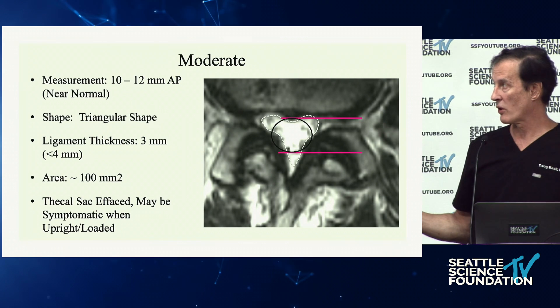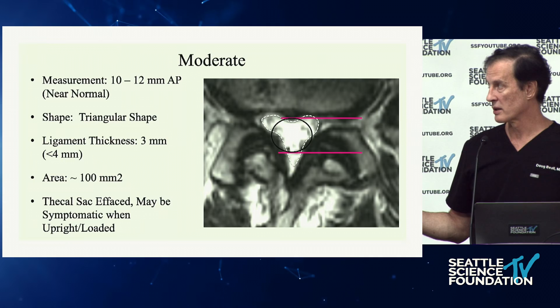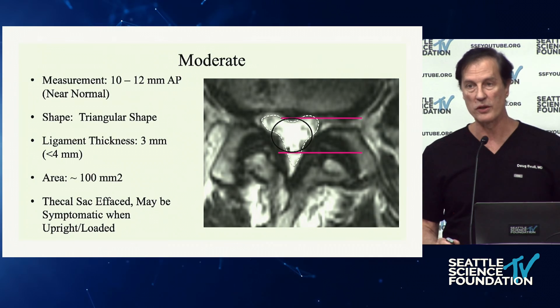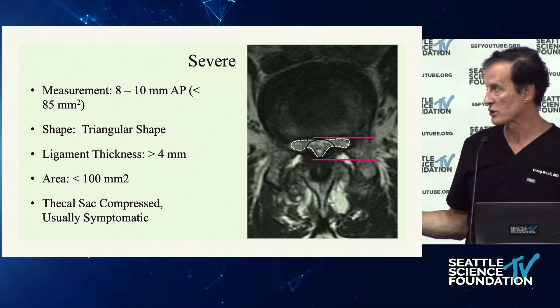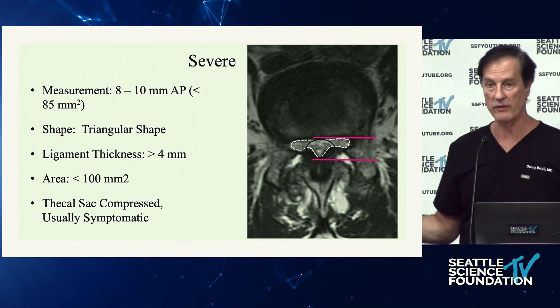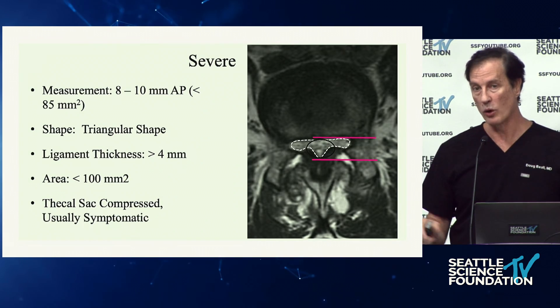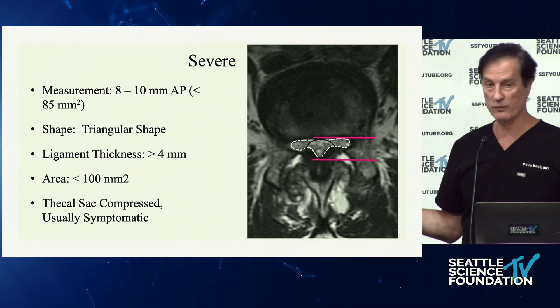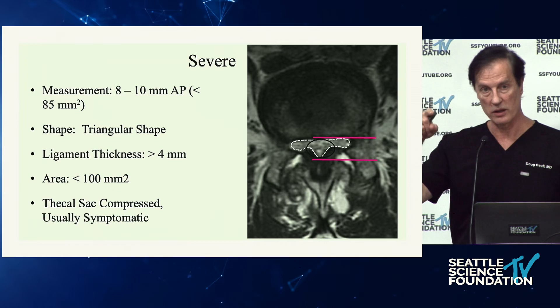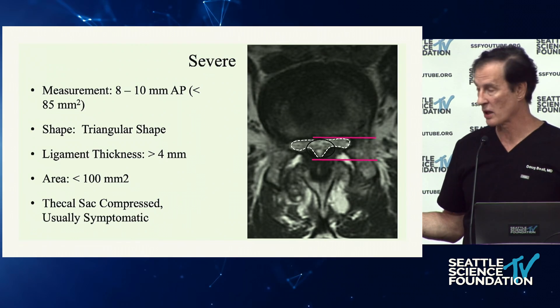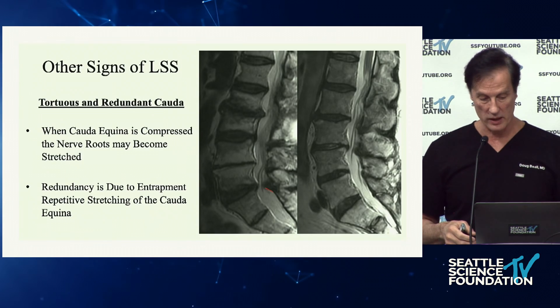Moderate stenosis: about 10 to 12 millimeters front to back, shape goes from round to triangular — some call this a trefoil shape. The ligamentum flavum is no longer thin and gracile; it starts to thicken to about 3 millimeters. By the time you get to severe, it's really triangular. Sometimes you have secondary signs because when this person stands up, the remaining CSF is going to go away. You can actually see this on an upright MRI — a great demonstration of that.